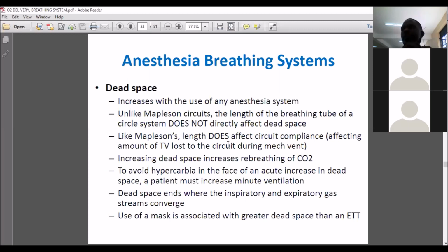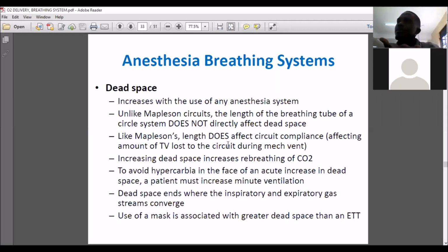No. They will breathe in as per their body responses. You can't tell the patient to breathe. But you just know that you also have to increase the oxygen concentration so that the patient has enough to breathe in. They breathe fast.